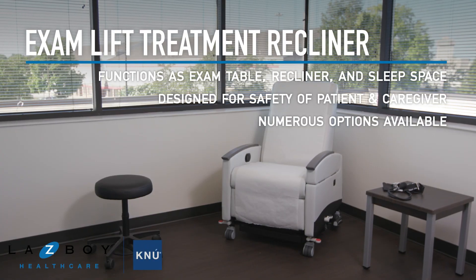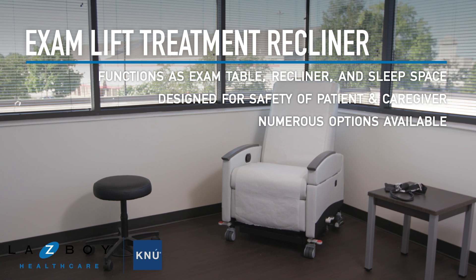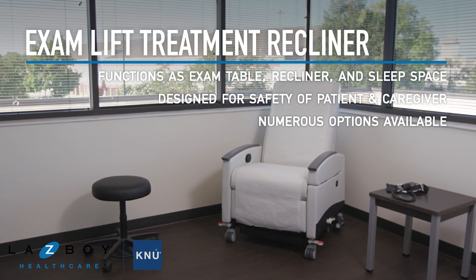This is the Exam Lift Treatment Recliner. Designed with three-fold functionality as a recliner, exam surface, and sleep space with true flatbed position.